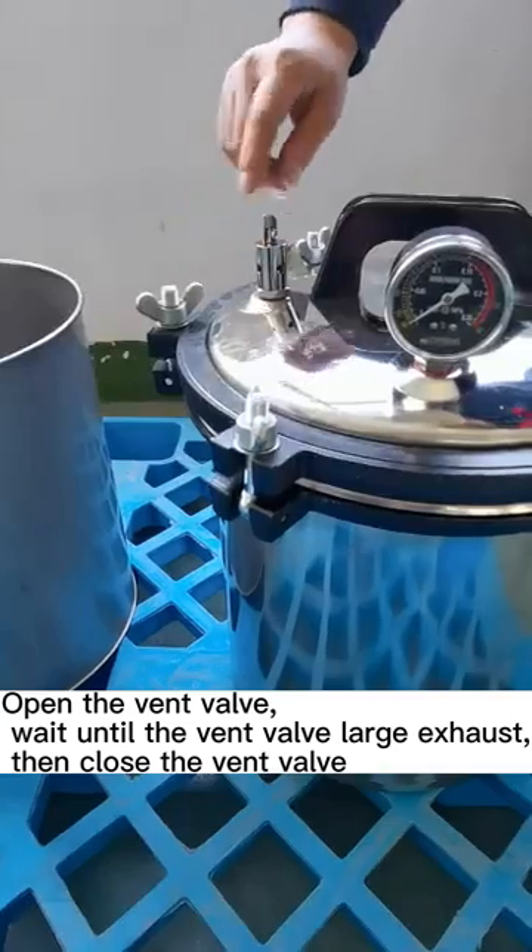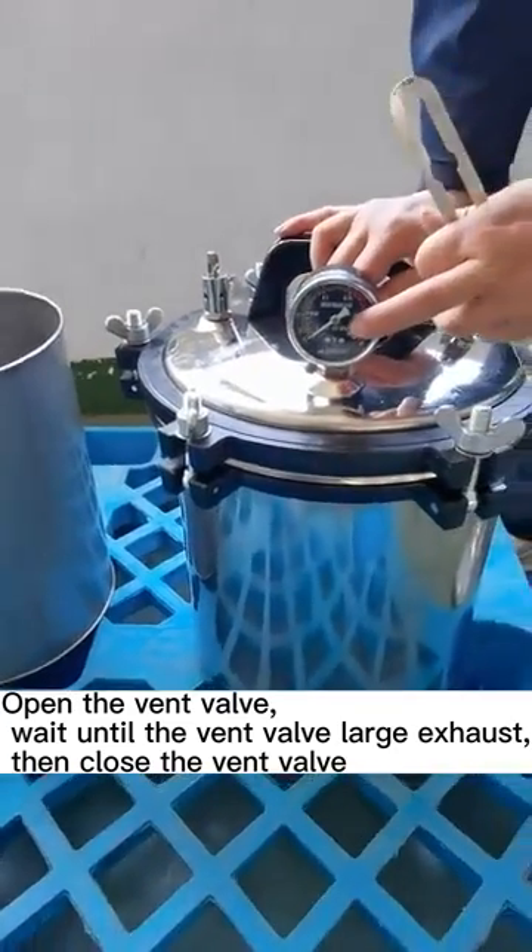Open the vent valve and wait until the vent valve exhausts a large amount of steam, then close the vent valve.